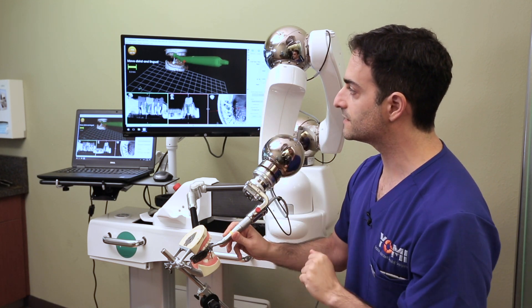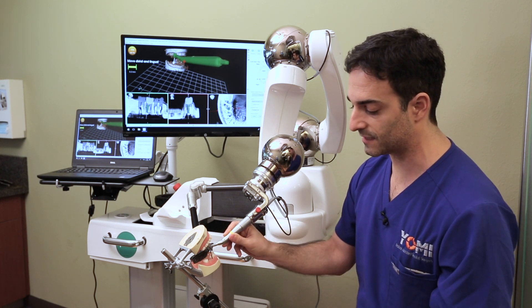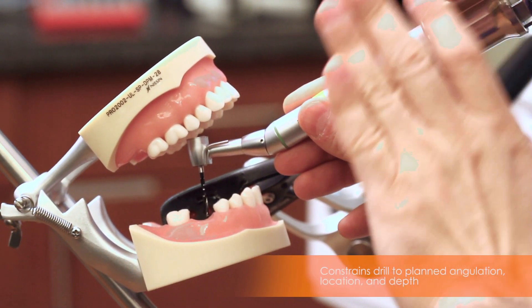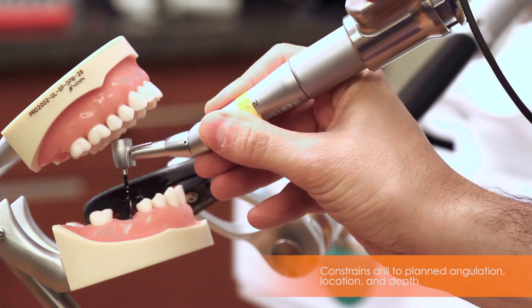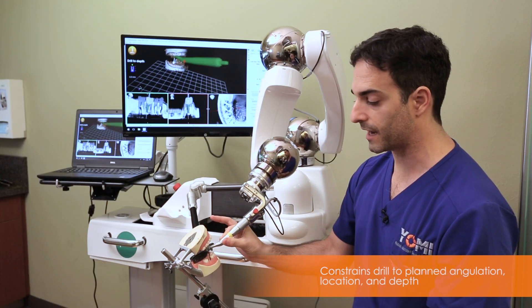It's saying on the screen I need to move about five millimeters distal and lingual. Again, physically it's going to be very easy — I just slide distal and lingual. It stops me again when I have the right position. So now I've got the right angle and the right position, and I can only drill in and out of the osteotomy. I can't deviate from that position or angle.